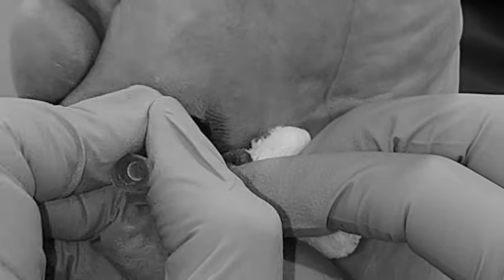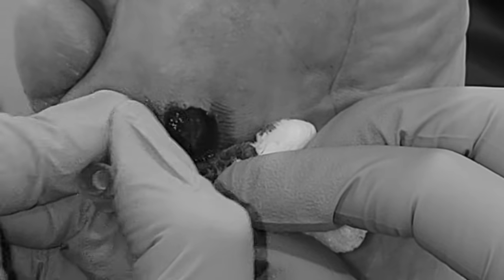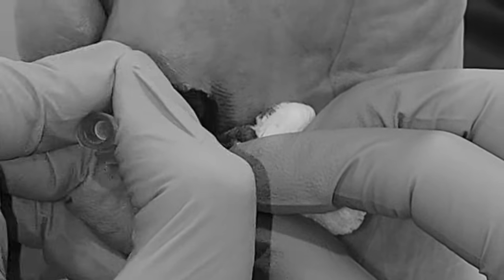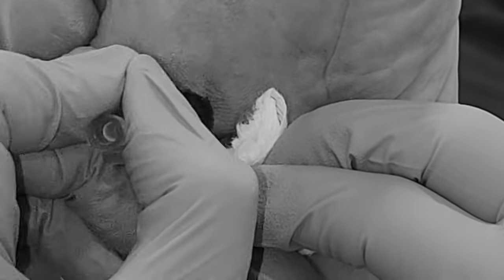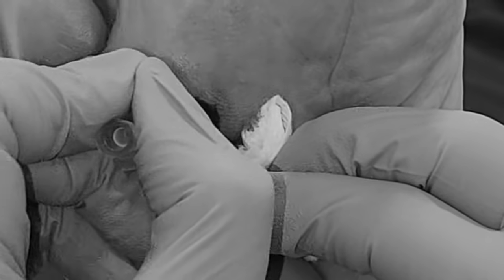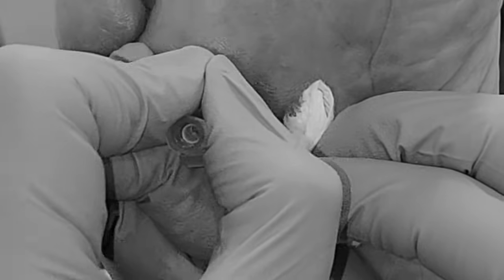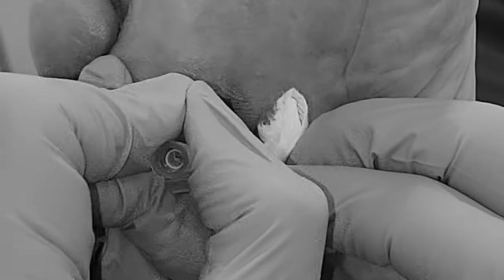We'll do a comparison. But sometimes verruca, they're stubborn. And it's great that this type of needling can sometimes get rid of it in one go, but sometimes it also just makes it smaller. But the good thing is, it was really painful before, wasn't it? And it's no longer painful. Yeah. And that's what we found with verruca needling, is that the pain aspect of it instantly goes away.